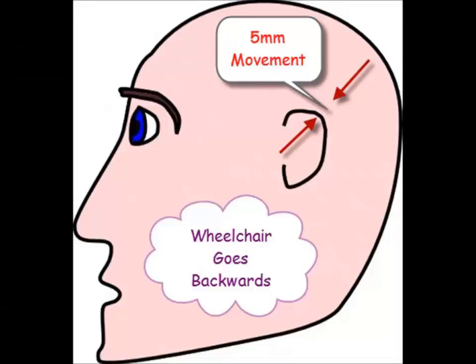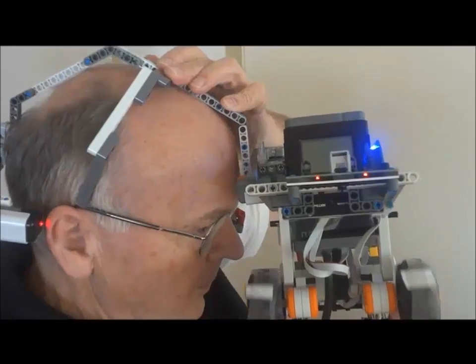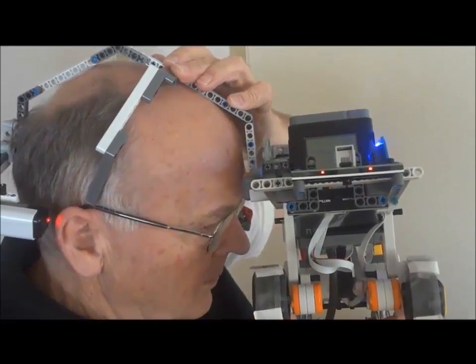We have about a 5mm ear movement that the sensor can detect, and when the ear is back, my robot C program sends the chair backwards. With the ear in its normal position, the chair stops.